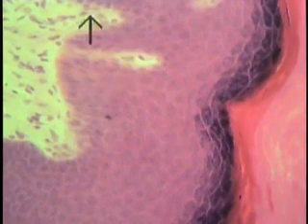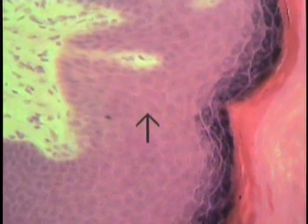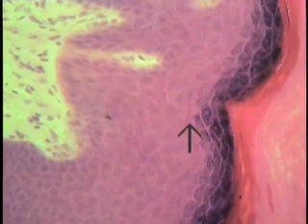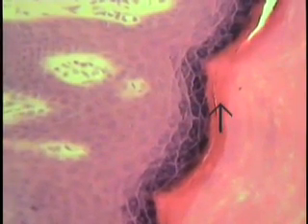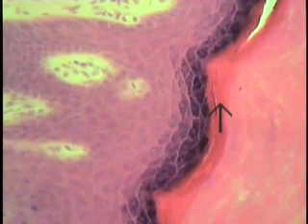Once again, this is where the epithelium begins. So it's lying on a basement membrane, though it's not completely visualized. One doesn't worry about all of these cells at the present time. You can see that it's made up of several cells of different sizes and shapes, some of which have granules, but that's not important at the present time. We know it's a stratified type of epithelium. These cells then flatten out to become the keratin. Therefore, it satisfies the definition of a keratinized stratified squamous epithelium, though it looks considerably different than the thin skin over most of the body.